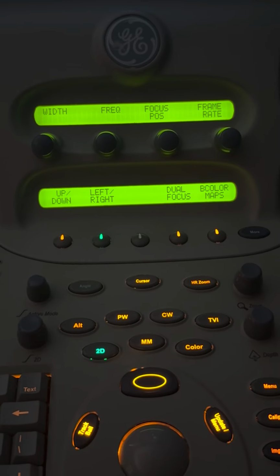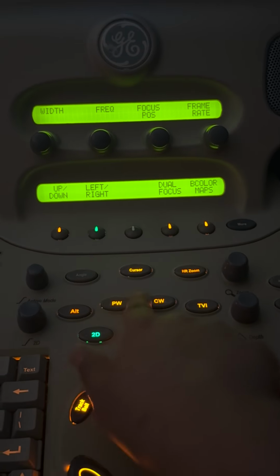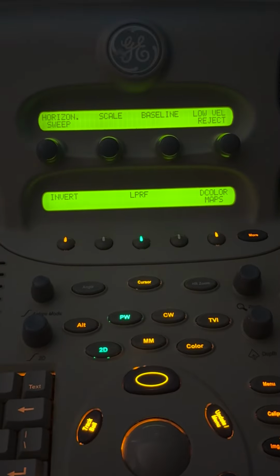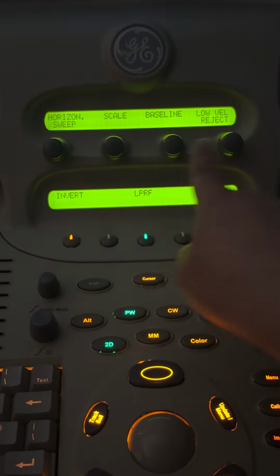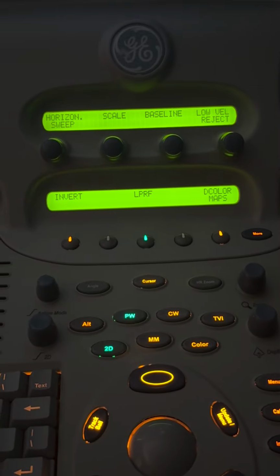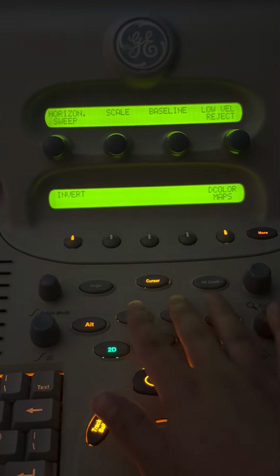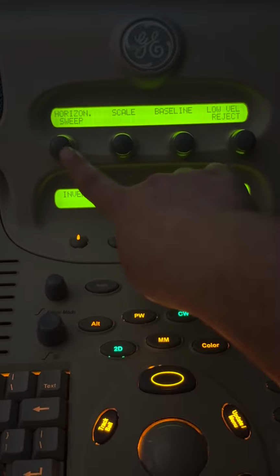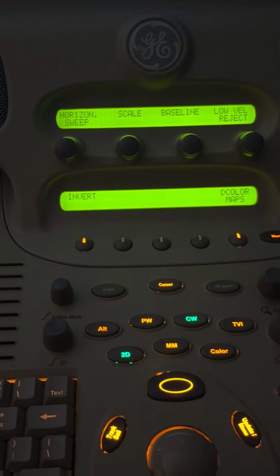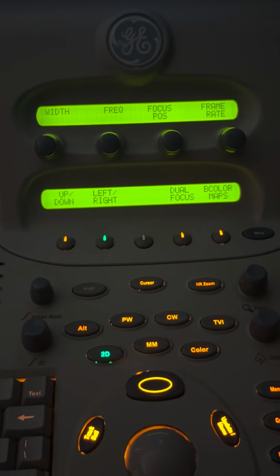Otherwise, whenever you are in a specific mode, so if I select one of my modes here, I have my pulse wave, I can select that. It will prompt me to have my settings for my pulse wave, M-Mode, continuous wave, so on and so forth. So I would select pulse wave or continuous wave, and I would be able to alter my sweep speed, scale, baseline, and reject. Always hit 2D to return back to your main scanning.